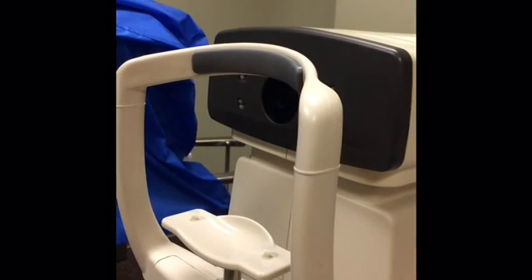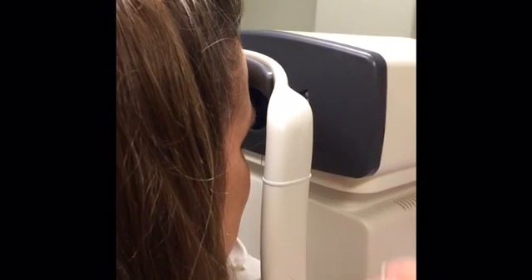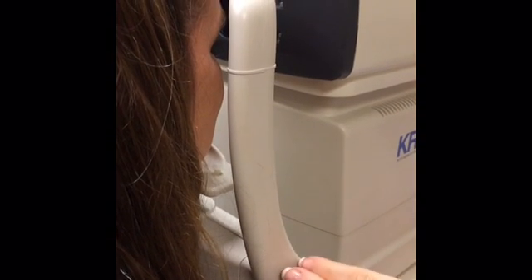Once your patient is seated at the AR, have them come forward and place their chin in the chin rest, forehead all the way against the bar. You can adjust the chin rest by turning the gray knob up or down.